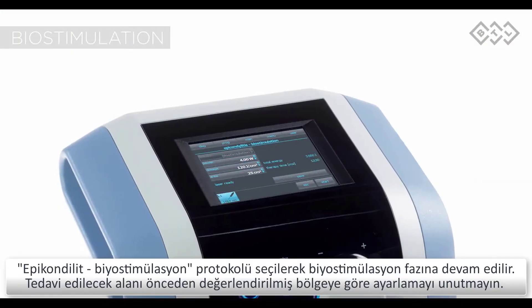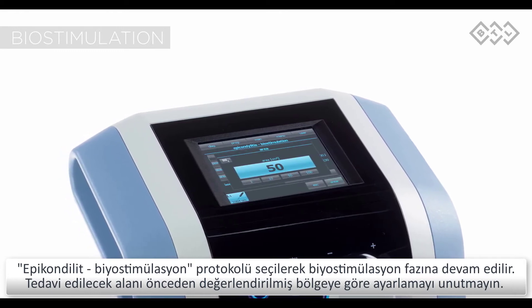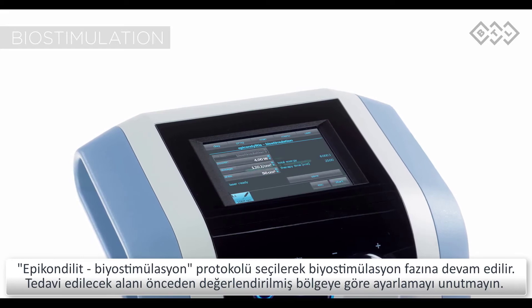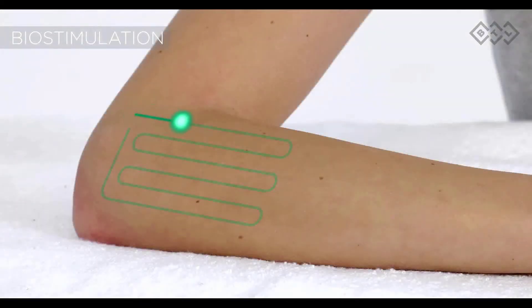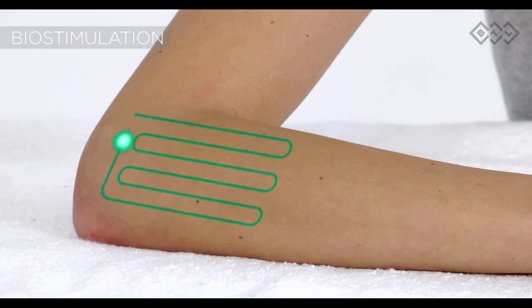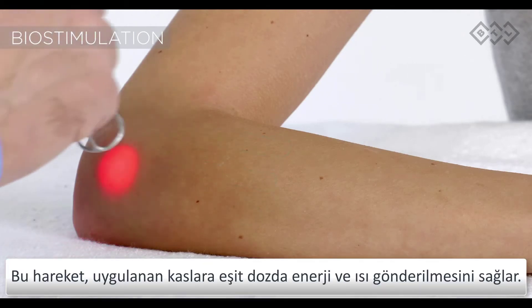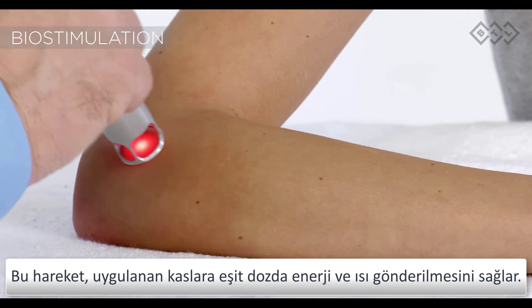Continue with the biostimulation phase by selecting the epicondylitis biostimulation protocol and again adjusting the area to be treated to the one estimated earlier. Proper biostimulation therapy is delivered by scanning along the treated area. This continuous motion creates a feeling of evenly spread warmth and stimulates the affected muscles evenly.